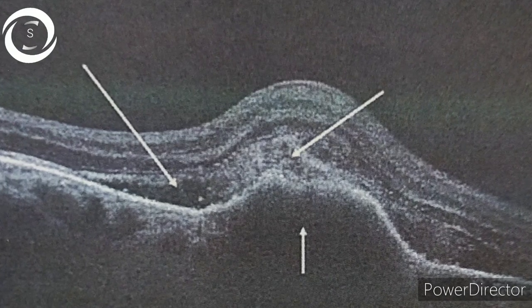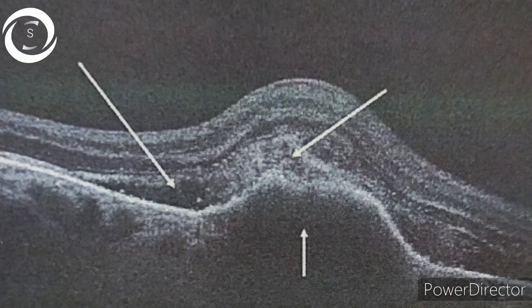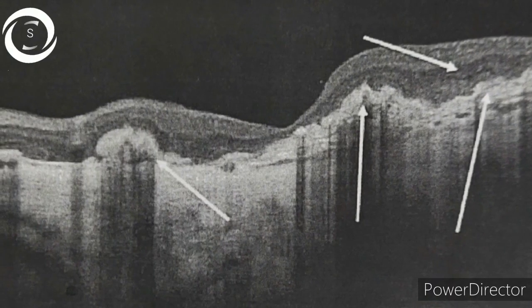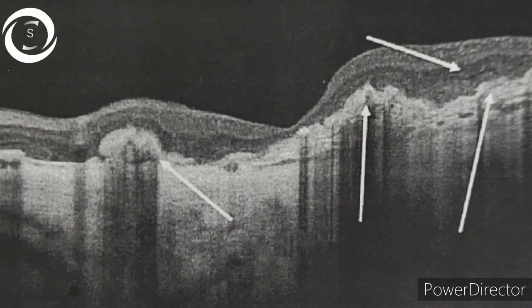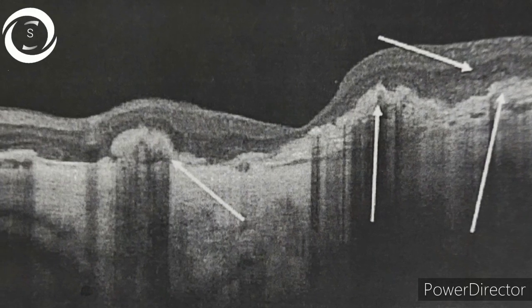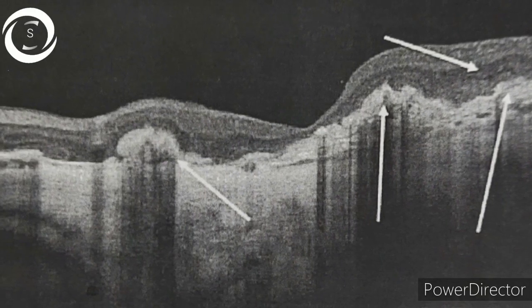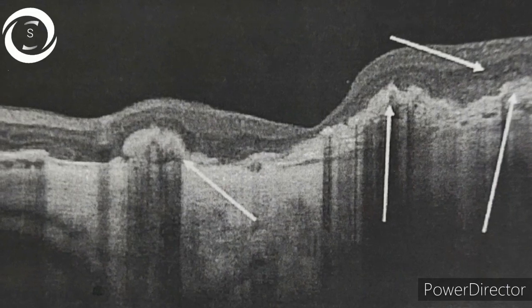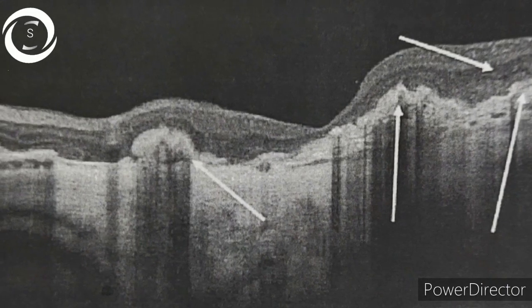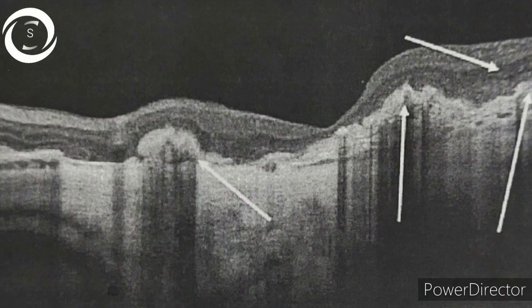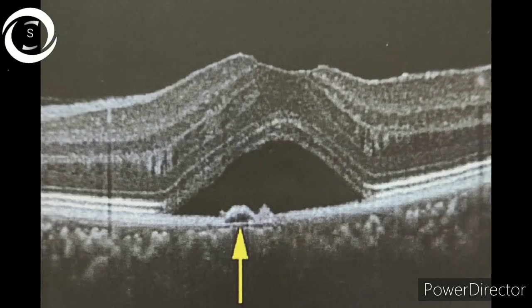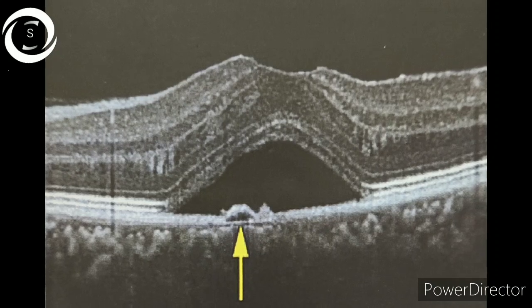In the fifth OCT, the hyper-reflective material is sub-retinal hemorrhage along with hypo-reflective fluid with a large PED. This is hemorrhagic CNV. In the sixth OCT, you can appreciate the white hyper-reflective fibrotic material present in the sub-retinal space — that is a disciform scar. There is loss of photoreceptor layers above the scar, and you can also appreciate shadowing underneath the scar.